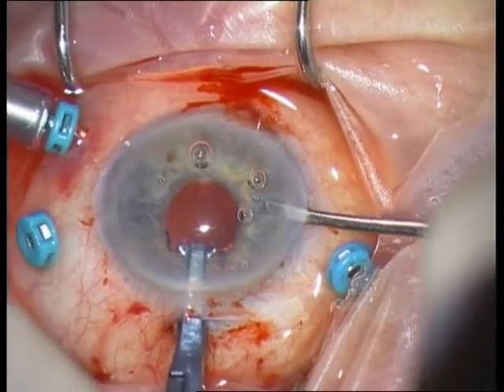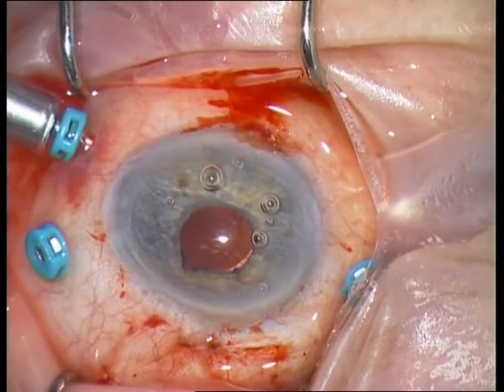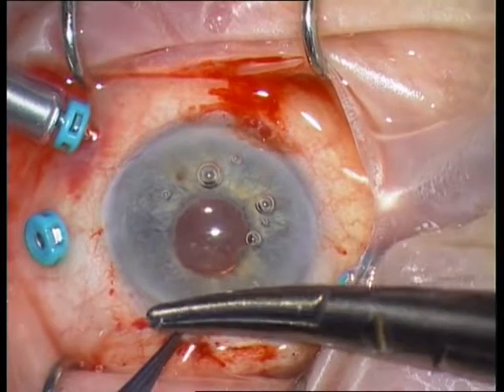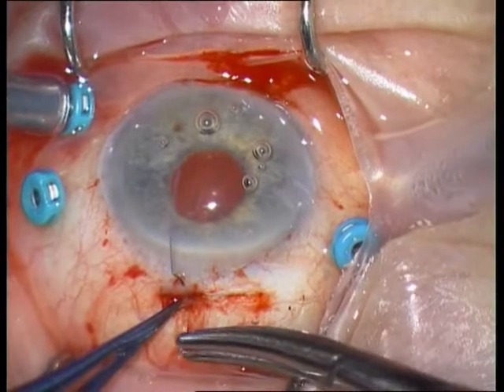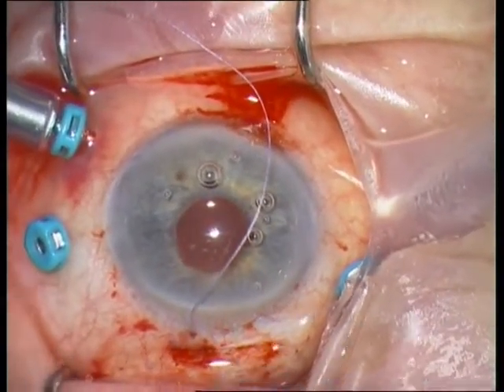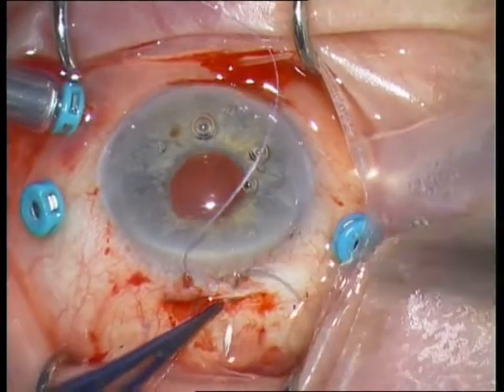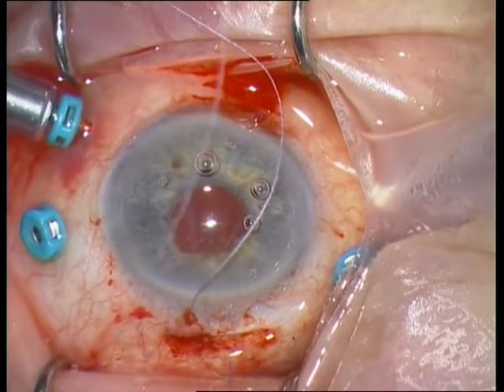Try to keep the IOL forceps steady in order to prevent iris trauma. Inflate the globe and suture the scleral incision with a cross-stitch Vicryl 8-0. The stitch only needs to be form-stable — don't pull it tight in order to avoid astigmatism.